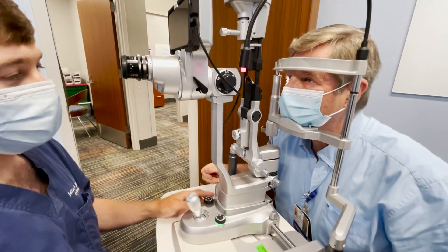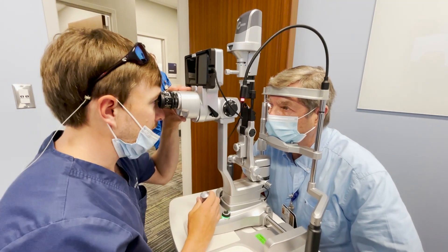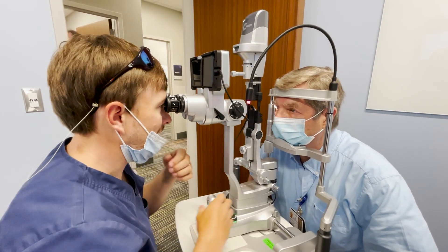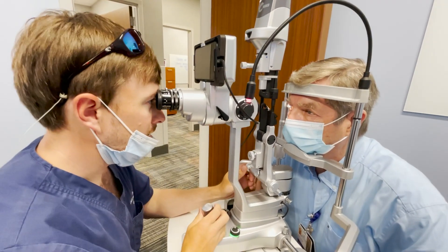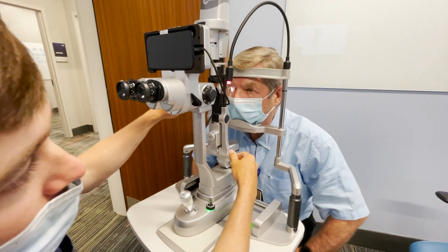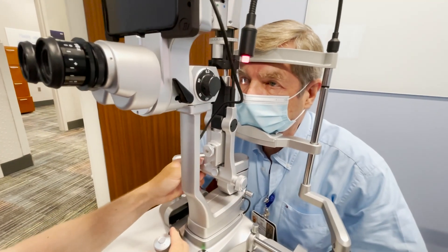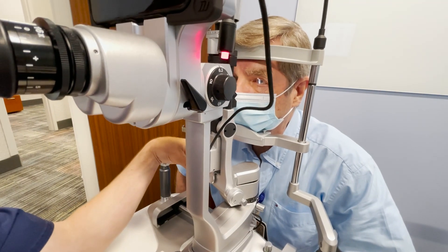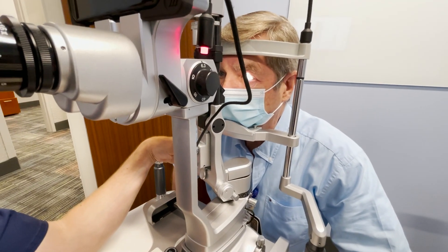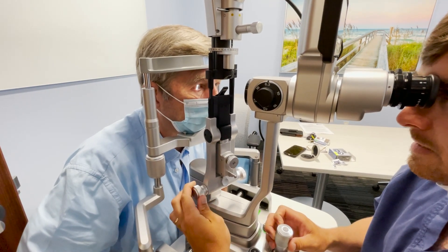With the patient's head all the way against the band, you can narrow or widen your beam using this knob right here. Turning it makes the beam very narrow, and turning it the other way widens the beam — from as wide as it can go to as narrow as it can go.